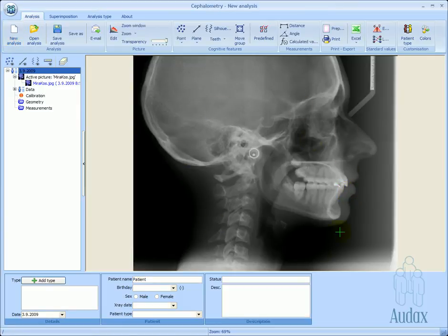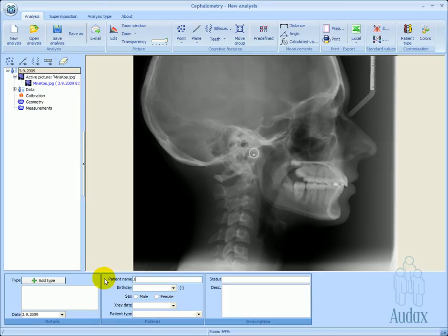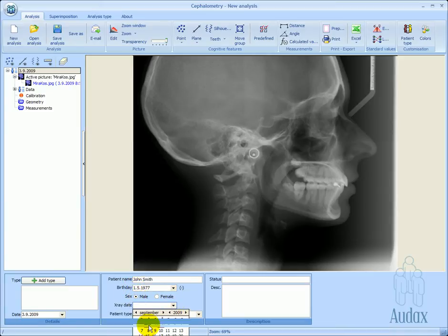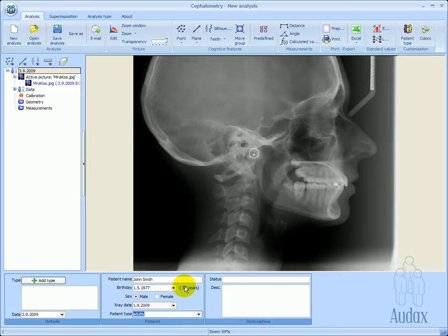Let's open an image. We begin by entering the patient's data: the first and family name, date of birth, sex, x-ray image date, and the type of patient. Based on the data we've entered, we can see this is a 32-year-old male, so let's choose adults.